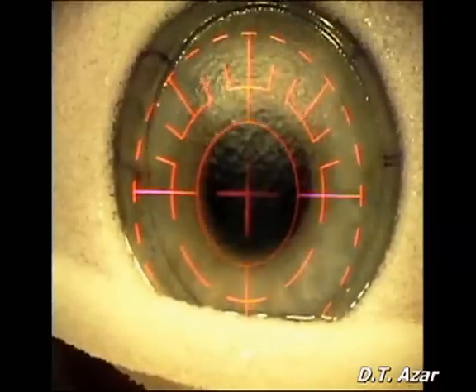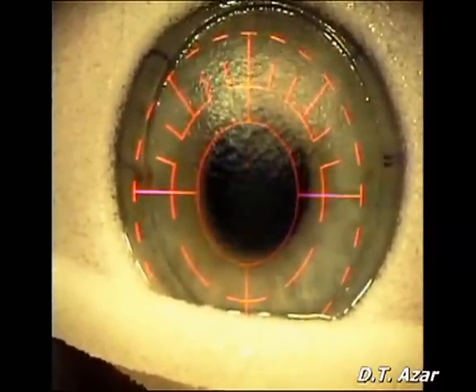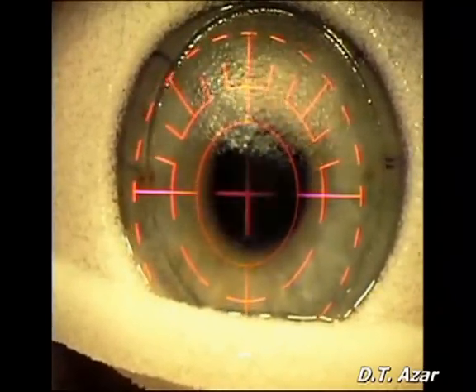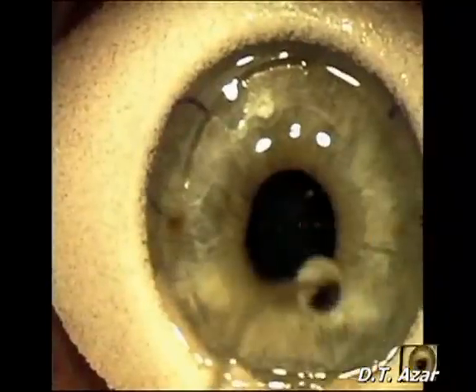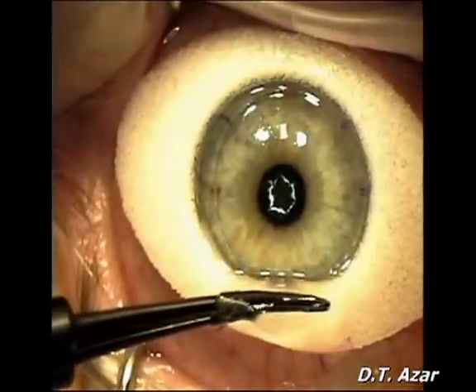With the patient fixating on the blinking fixating red light, the eye tracker is activated and the laser is applied. The fixation is checked throughout the entire procedure. The sponge is removed and the stromal bed is irrigated with BSS.